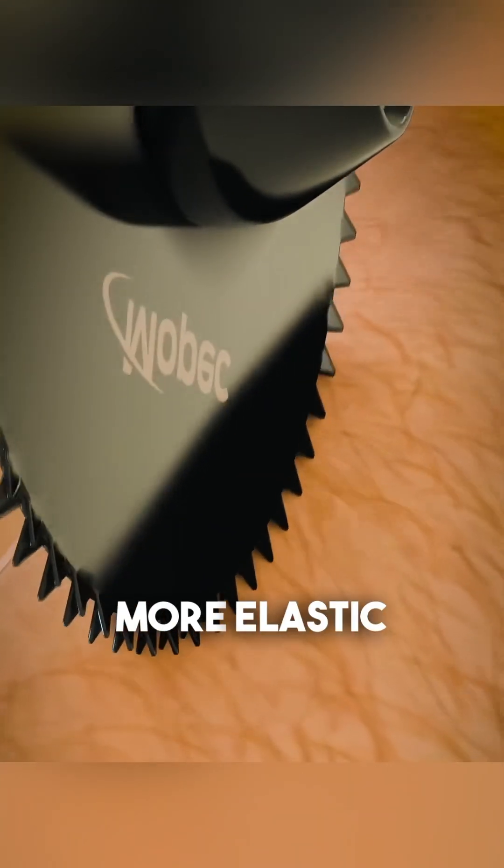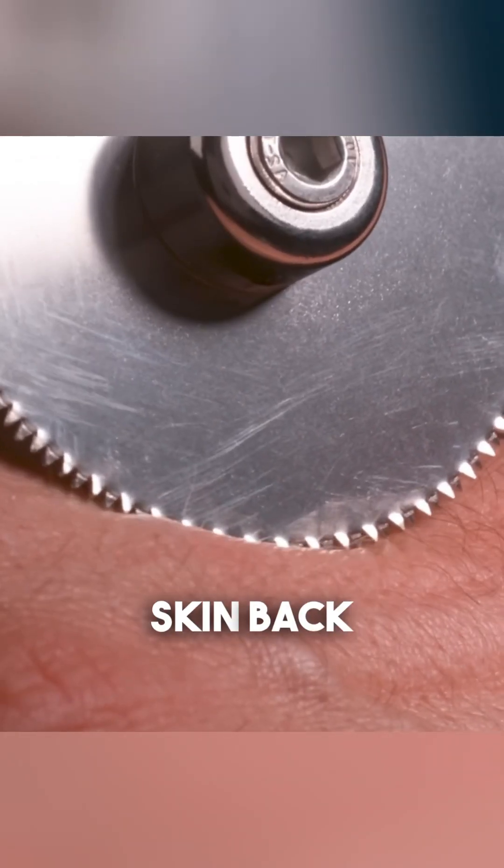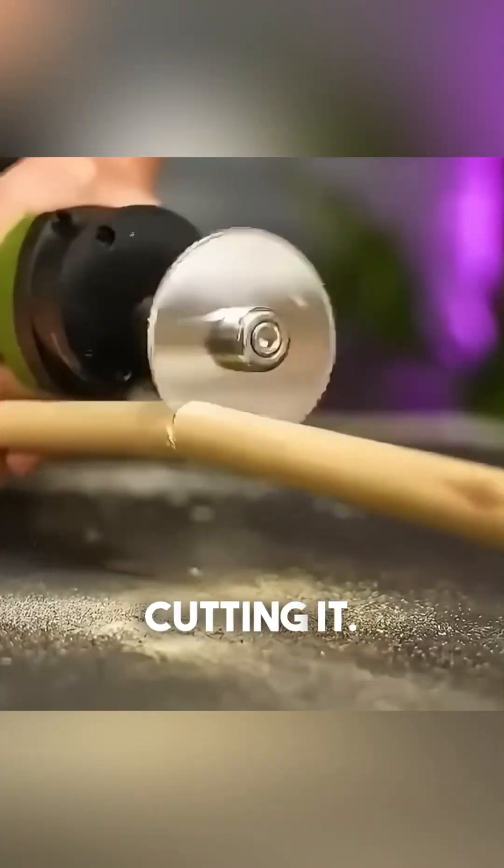But when it comes to softer, more elastic materials like your skin, the blade's small teeth can't get a grip and instead just push the skin back and forth without cutting it.